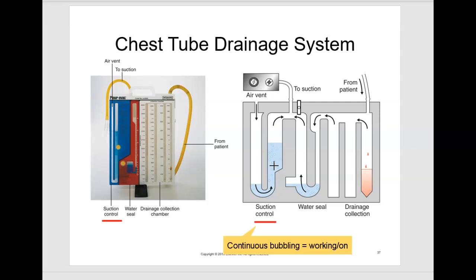There are other types that have dry suction, and basically the provider will prescribe the suction level to be dialed into a device, so they don't use liquid to obtain that suction. And it's important to note the amount of suction in the system is determined not by the wall unit, what you're dialed up to, but by the amount of fluid indicated on the manufacturer's guide or by the physician as to how high you should fill that.